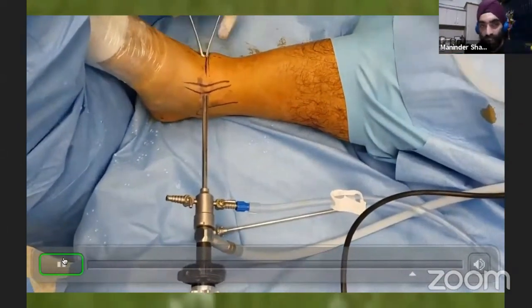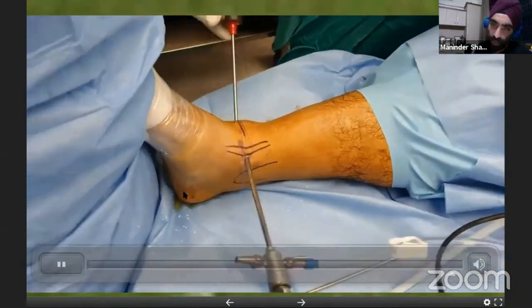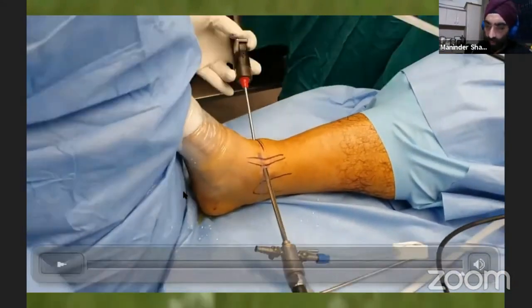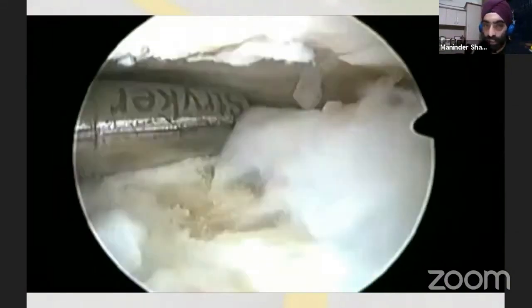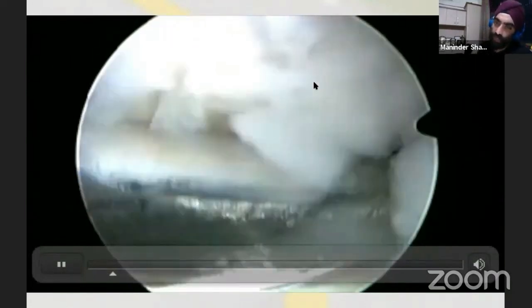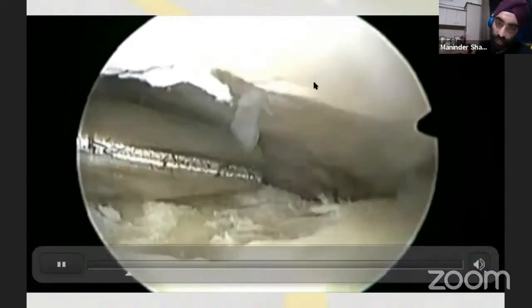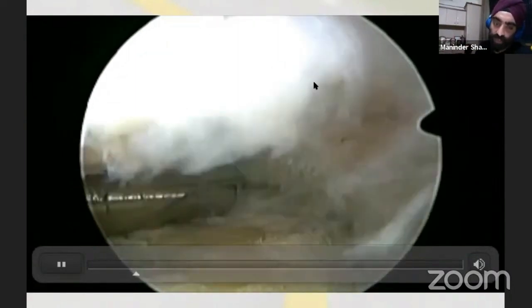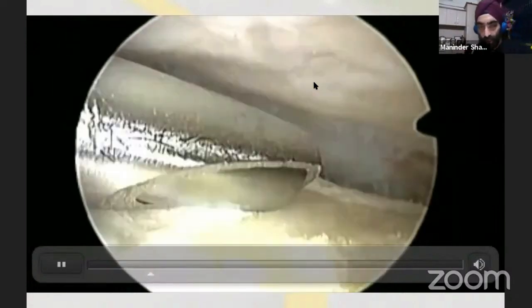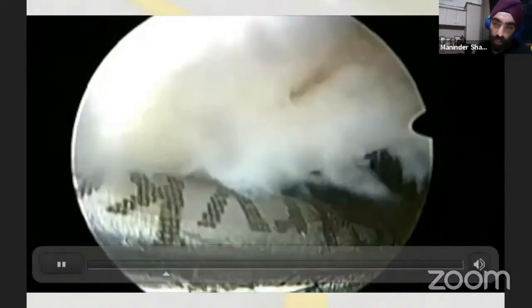Once you've established the two standard portals, apply traction. You can use a proprietary ankle arthroscopy strap with a postgraduate assistant pulling — this is more convenient than a static traction device because you retain the ability to dorsiflex the ankle during the operation. Inside you'll see a lot of synovitis, especially in this case, and grade 4 cartilage changes on the tibial side.